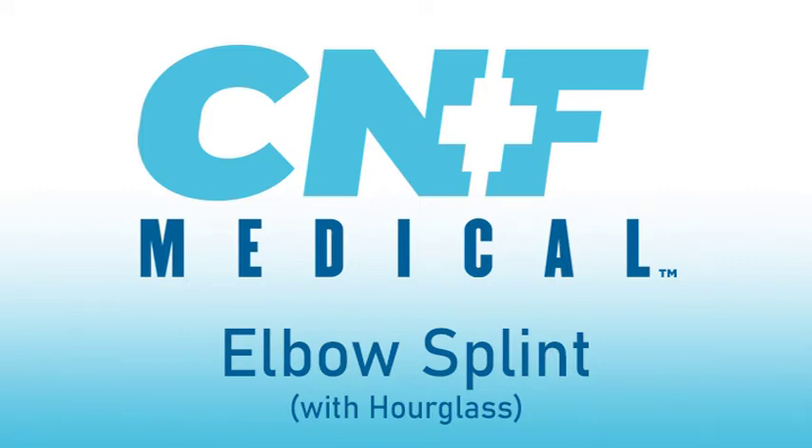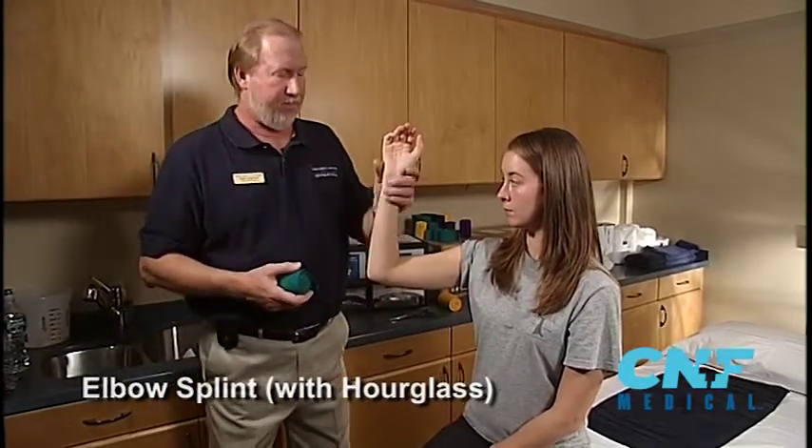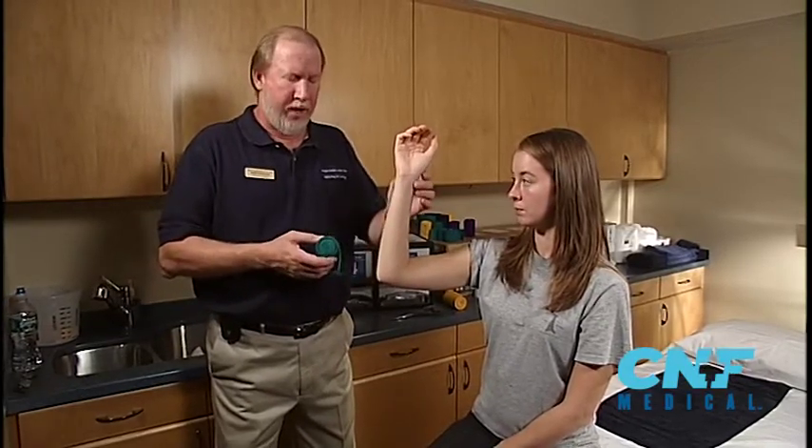This demonstration will be the elbow posterior elbow splint. Indications: any elbow injuries, supracondylar fractures, things like that. But any elbow injury, this splint will be fine.